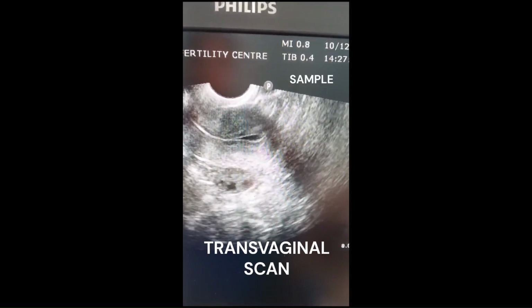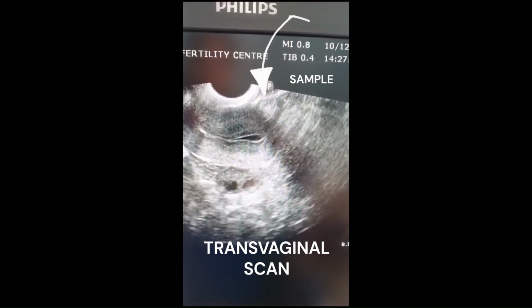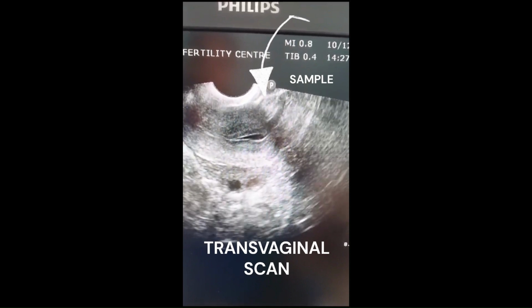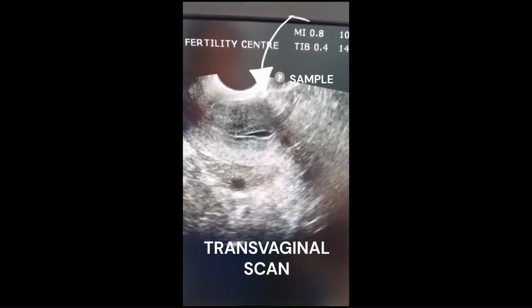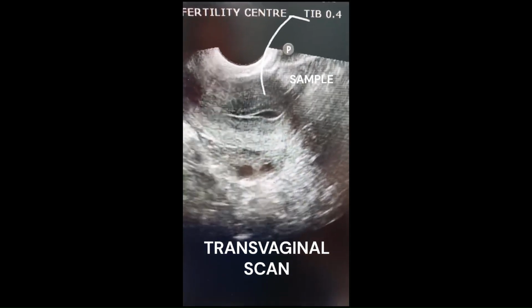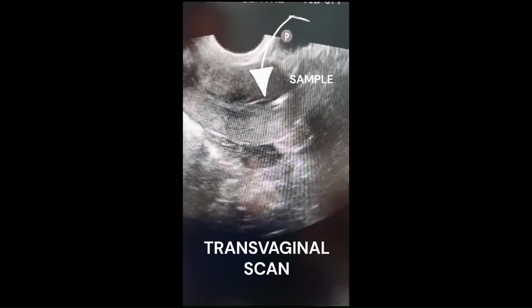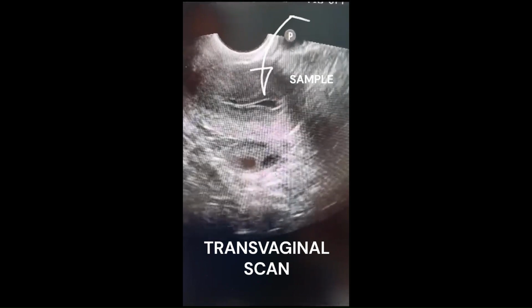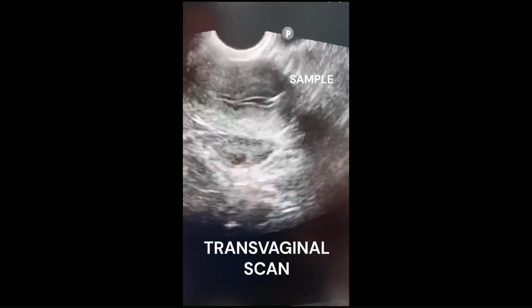After having done this, we push the processed semen sample into the uterine cavity slowly and make sure that the cavity gets distended by the fluid that we are sending inside. So, this is how a transvaginal scan guided IUI helps in improving chances of pregnancy in patients who have a patulous cervical canal or wide open internal os.